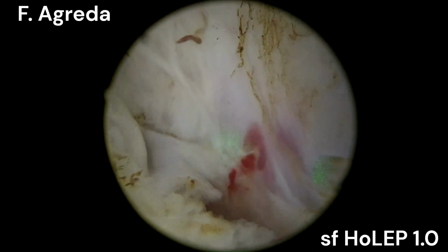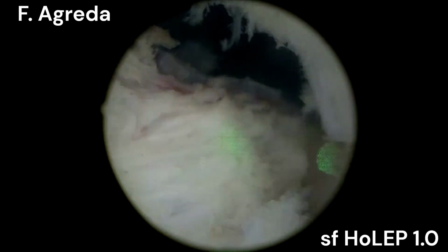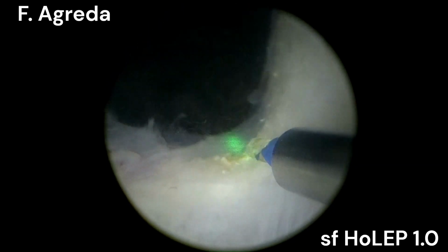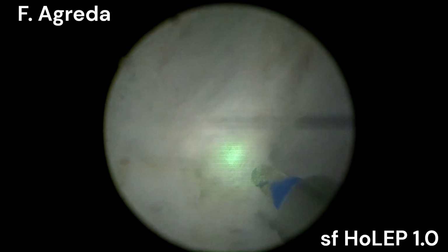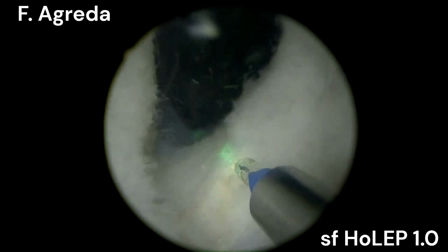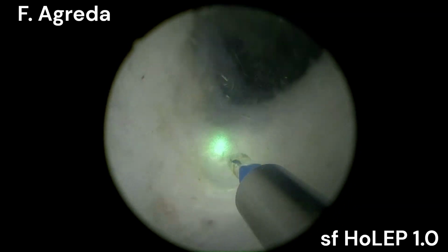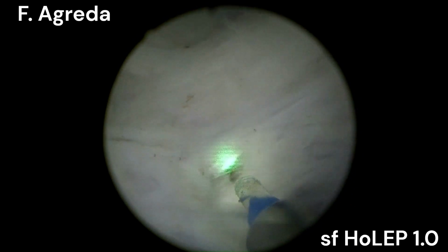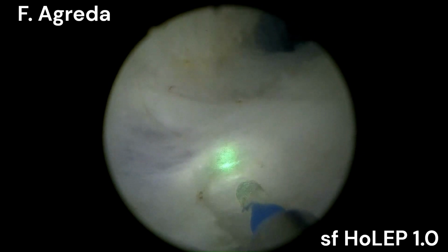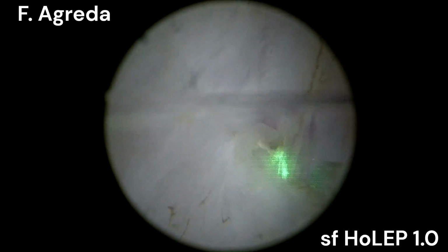Same here, as I told before, I'm not progressing in a retrograde manner. I'm progressing from lateral to medial, from 3 to 6 o'clock. We see the prostate as a tube, and the semi-ovoid or spheroid shape of the prostate. We're going from the lateral to the medial aspect of the adenoma as a whole, as we are dissecting the adenoma in a whole piece, not doing any separation or fragments or lobules.